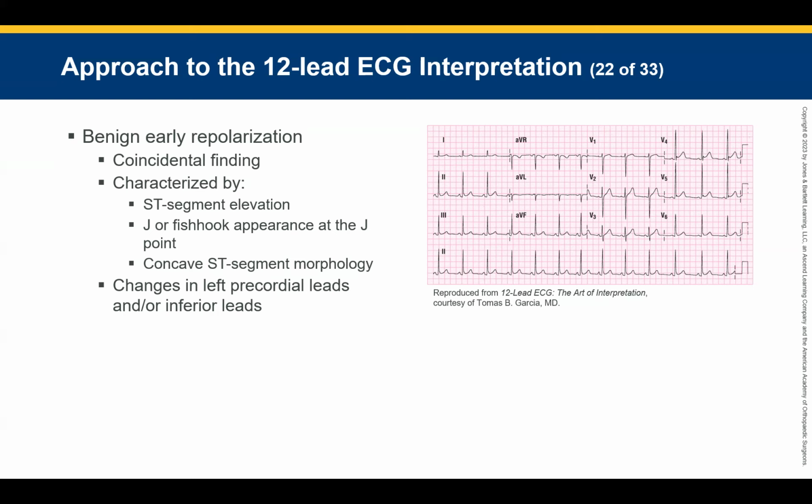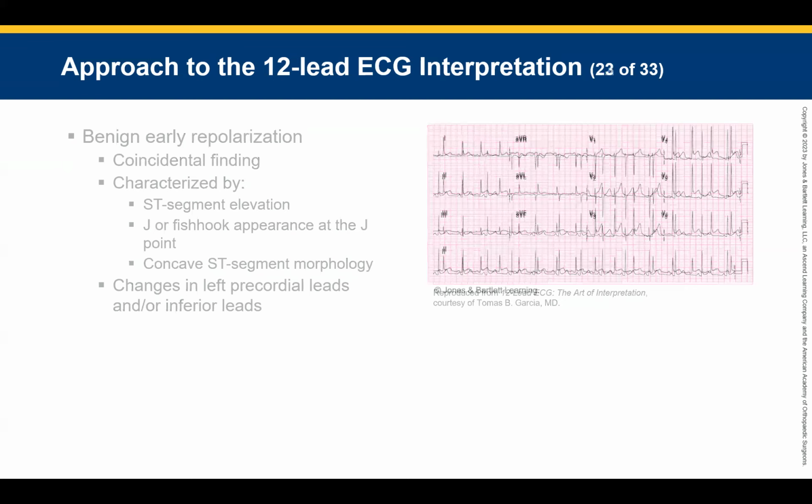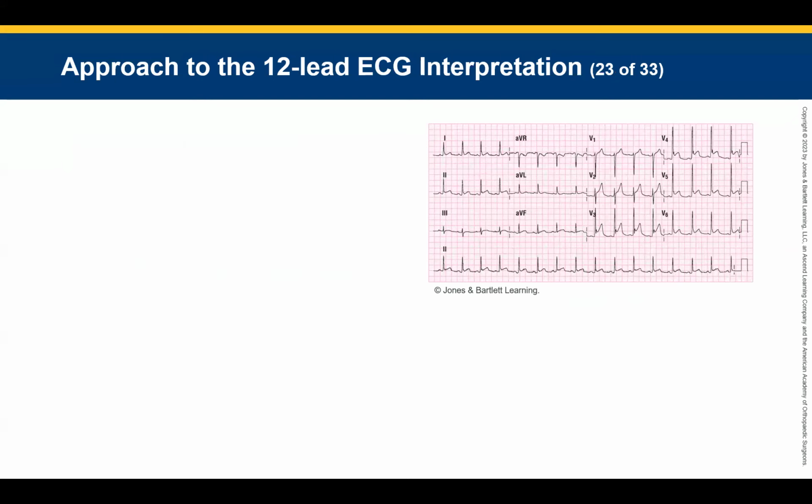Does hypertrophy matter? Well, it could, but we're going to treat symptoms. Bundle branch blocks could matter. Could be a heart attack. We're going to look at that later more. Let's go to this next thing.